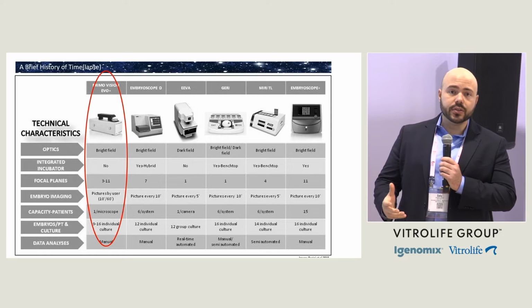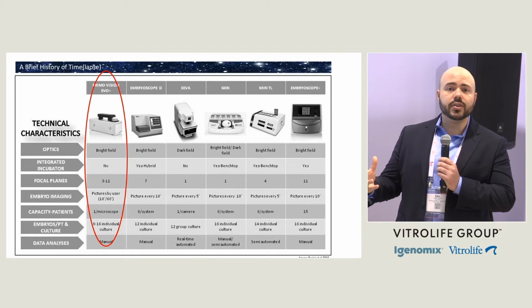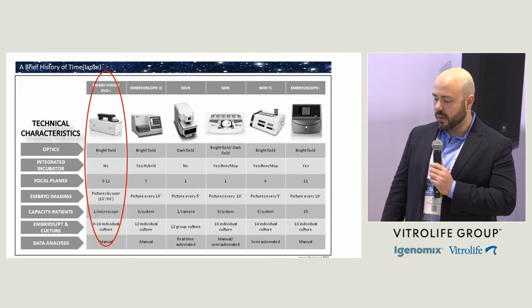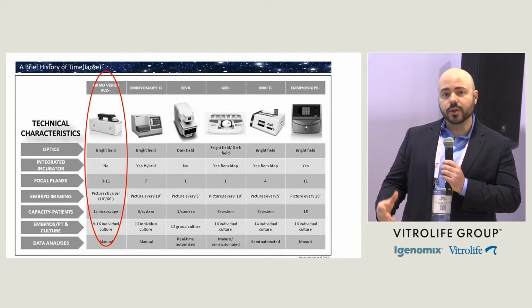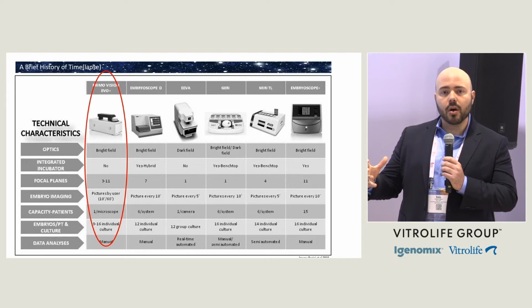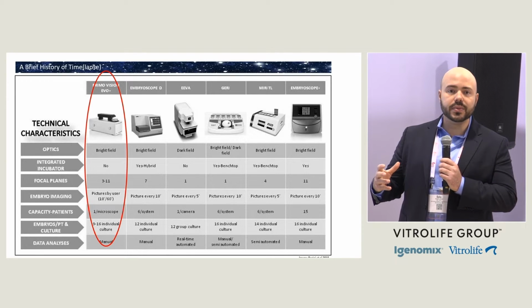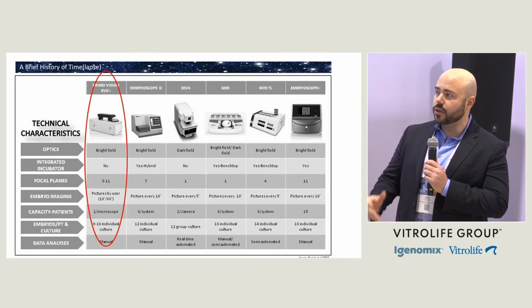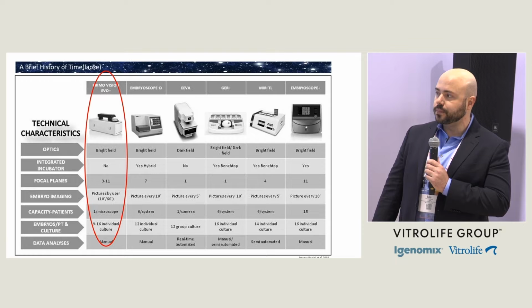Then there's your capacity. Are you a big center that requires a large number of slots for your incubator? Or are you a small practice where the number of embryos per dish is important? So you want to take a look at that as well.